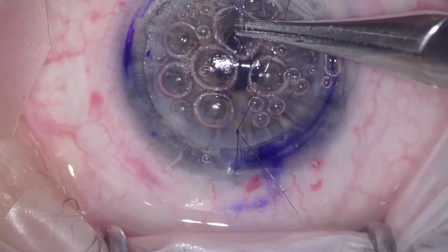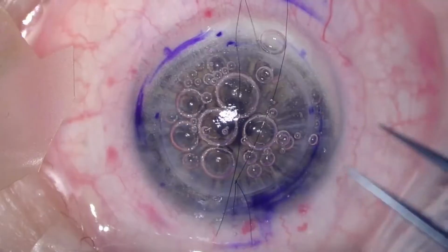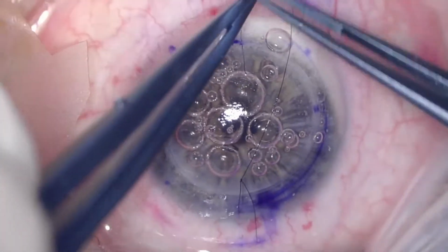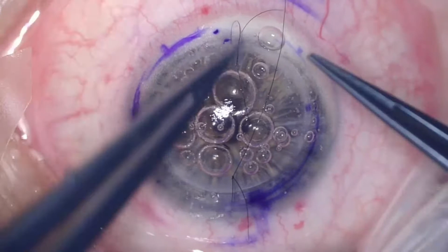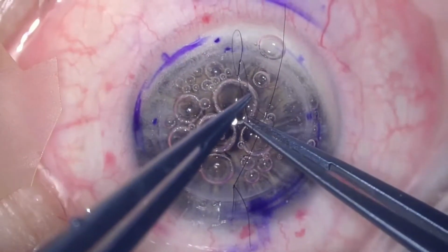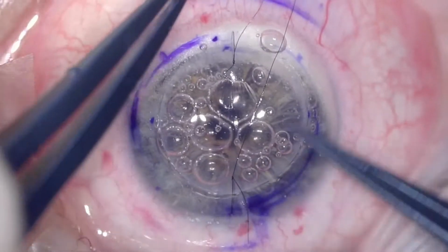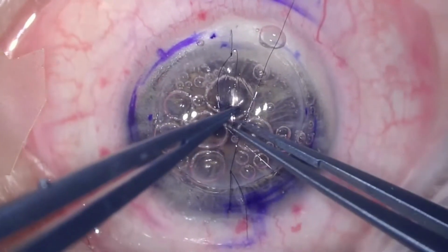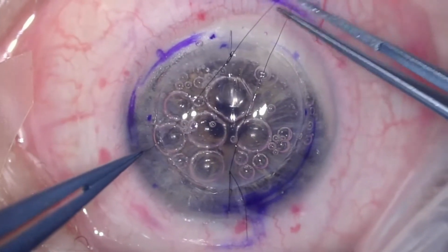This is because I want to put my second cardinal suture in and then adjust the tension for the first one to make sure I start off with the proper tension on the graft. So now I'm just tying my second cardinal suture, trying to judge how tight I should do it based on how the cornea is behaving. And I'm looking at the tension created between the untied suture and the one I'm tying now.